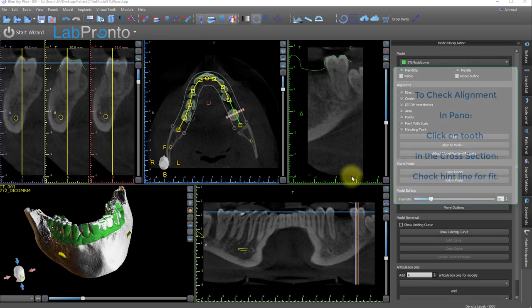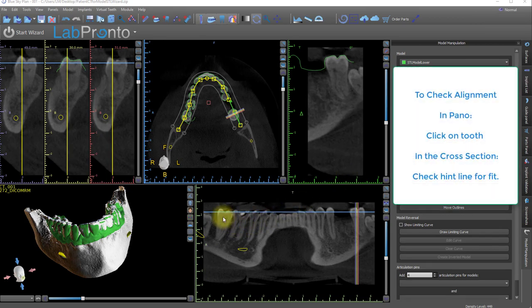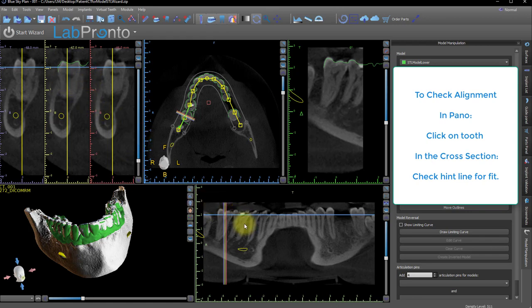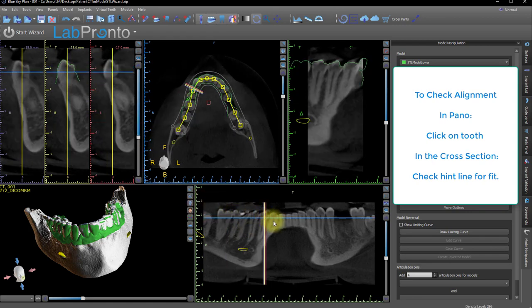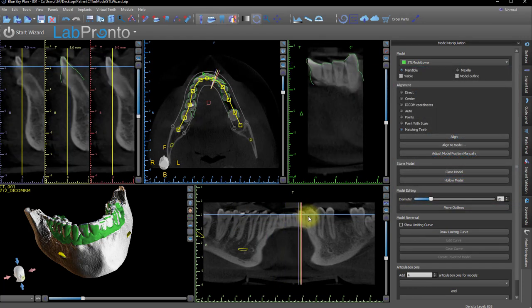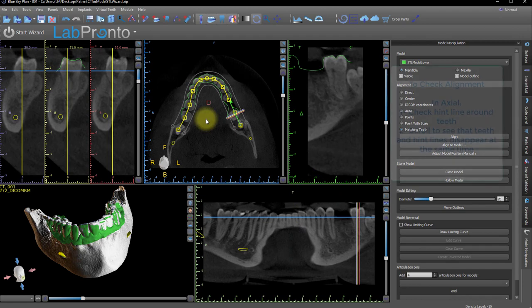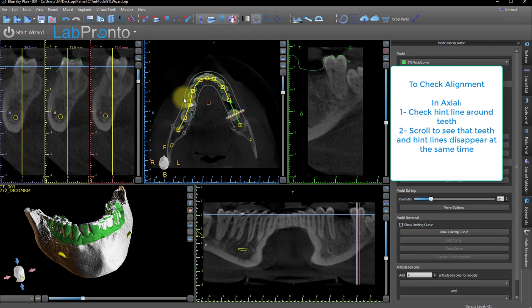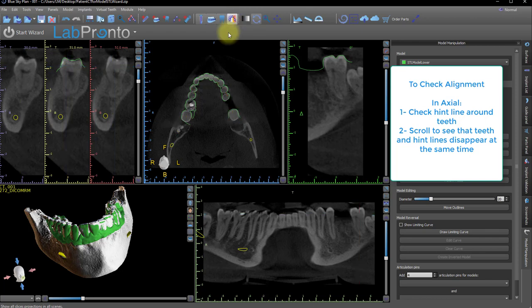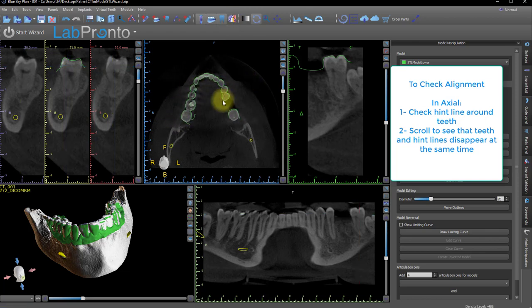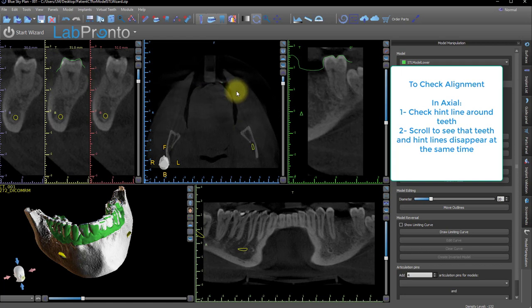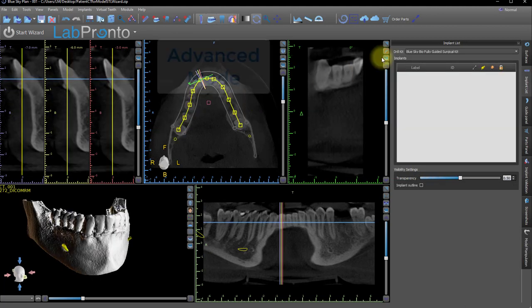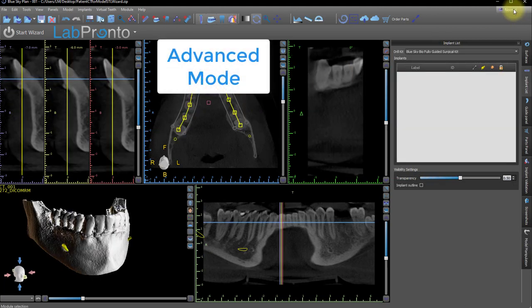Back in the standard view, click on each of the teeth in the panoramic and notice how the hint line hugs the crowns — a good indication that this was a successful stitch. To further check the stitching, scrolling with the scroll wheel or dragging the scroll bar in the axial view, watch the hint line to make sure it and the teeth disappear at the same time. We have the projections in the way, so I'll go up to the All Projections toggle switch. Now with a less obstructed view, I can scroll up to see that the teeth and hint lines disappear at the same time.